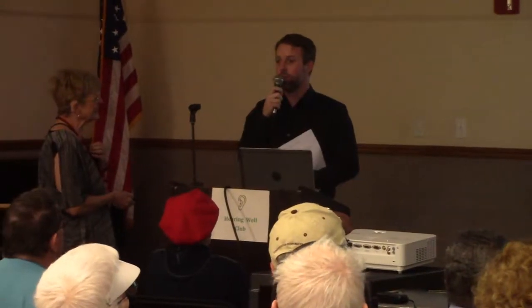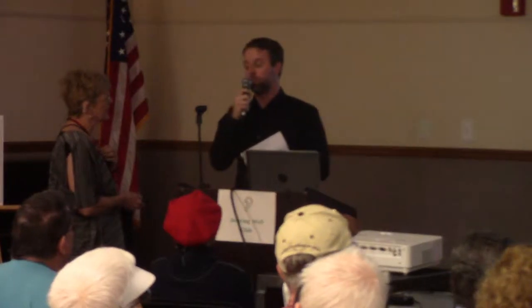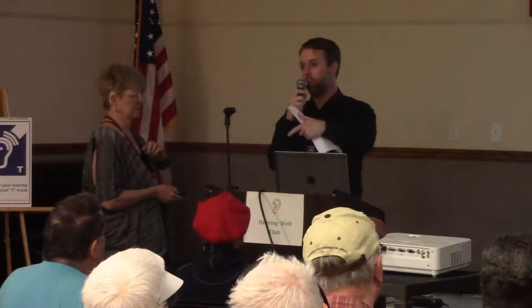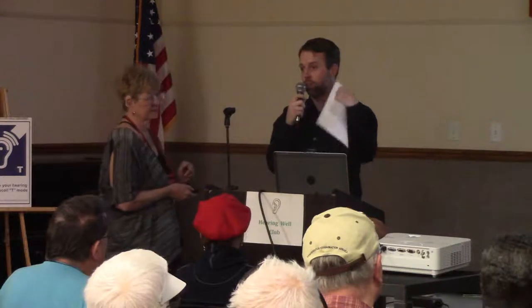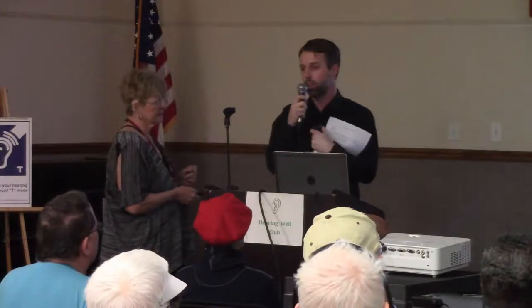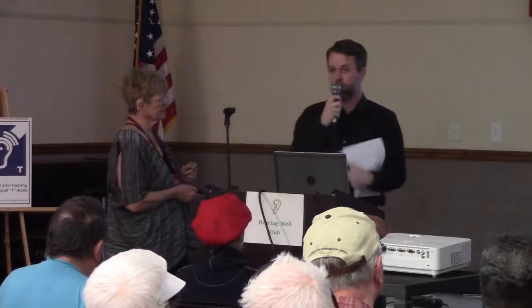She thought I said that our venue was looped, but I was saying that your room here is looped, so you don't even have to check out a device. You can just turn on your hearing aid or your T-coil, and that'll play straight to your hearing aid without wearing a device. But at our theater, you do need to check out a device and a loop, and then you can hear the performance using the loop.